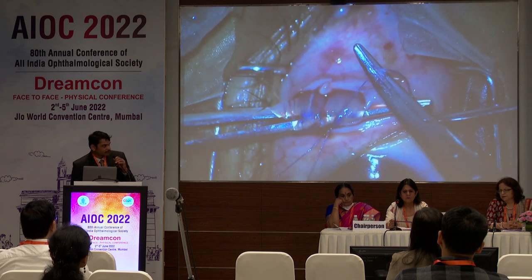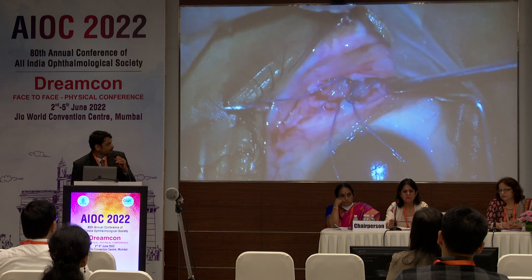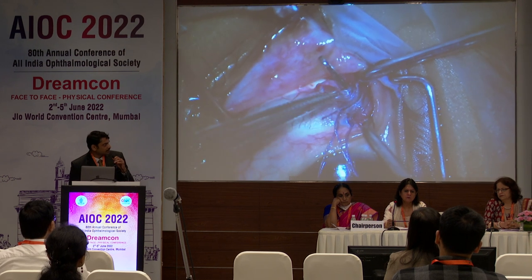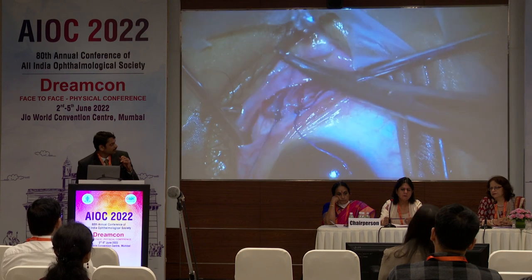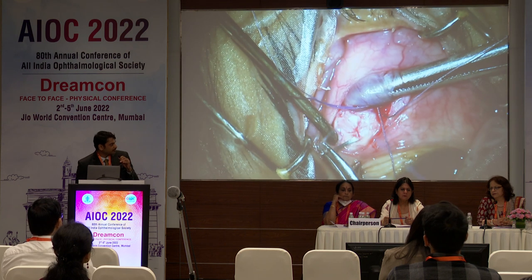From one end we have tied, then we'll slowly remove the muscle forceps. As you can see, there is a fold and the ciliary vessel is also spared. Then we will suture the inferior end. And now you can see the marked end has moved forward. Similarly, we can do the lateral leg plication also.